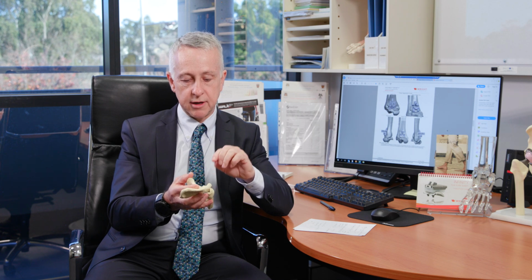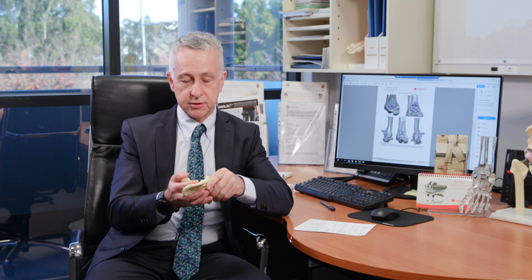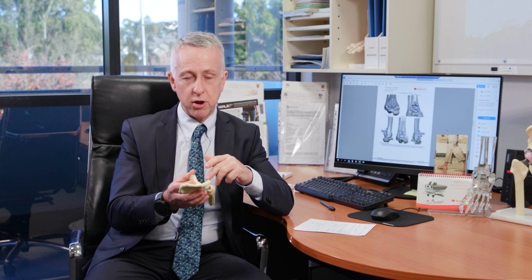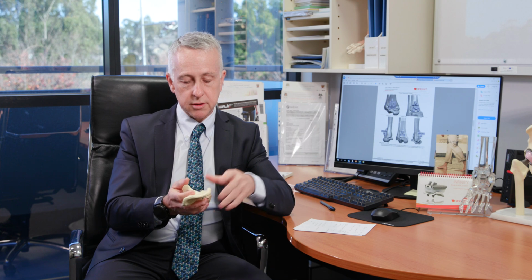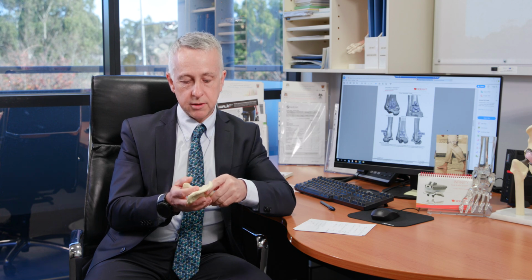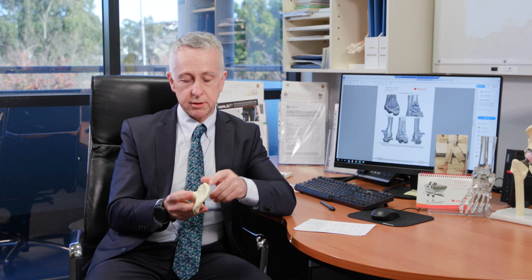So that's a three-phase process. Pre-operatively, it's a clinical examination, and we do a CT scan. The CT scan gets analysed and allows us to work out potential component size, what the optimum positioning of the components are, and what the pre-operative offset and leg length is. And that gives us goals that we want to achieve in theatre. The navigation in theatre helps us reproduce those goals and gives us accurate feedback. And then post-operatively, we do x-rays and we can analyse those as well, to ensure that we reproduce those goals.